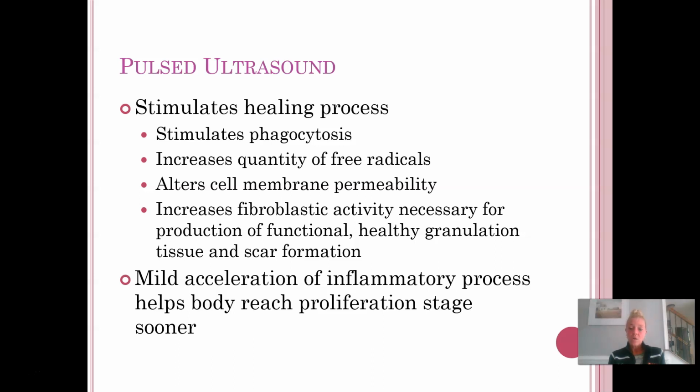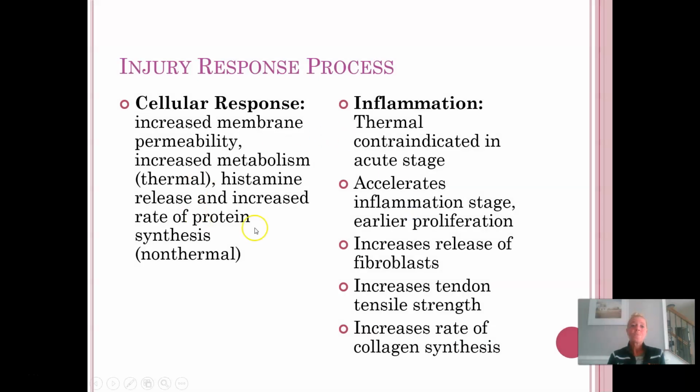Pulsed ultrasound is also believed to sort of accelerate that inflammatory process, which helps us get into that proliferation stage a little bit sooner. So again, everyone wants out of that acute inflammatory stage as quickly as possible. That's why we rest and we ice and we try to get through that so that we heal even more quickly. And so pulsed ultrasound is supposed to help with that as well.